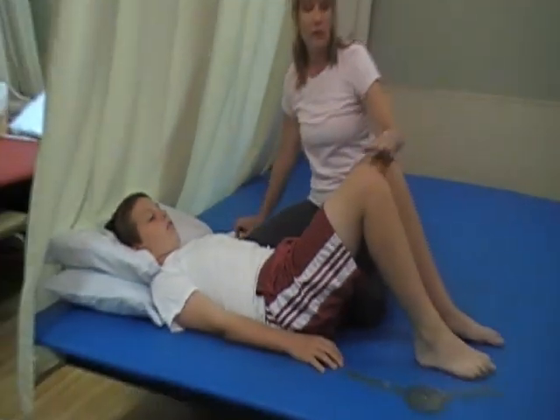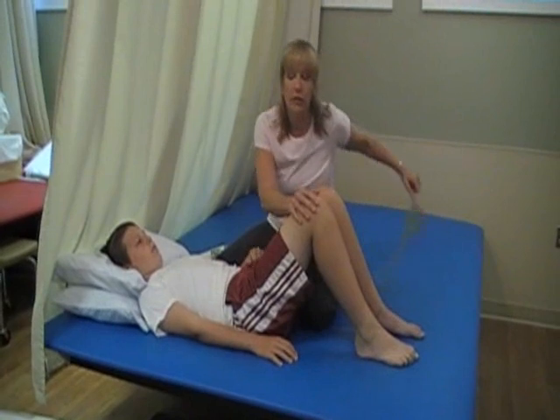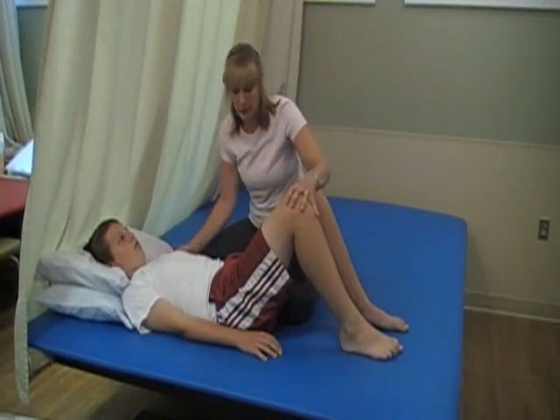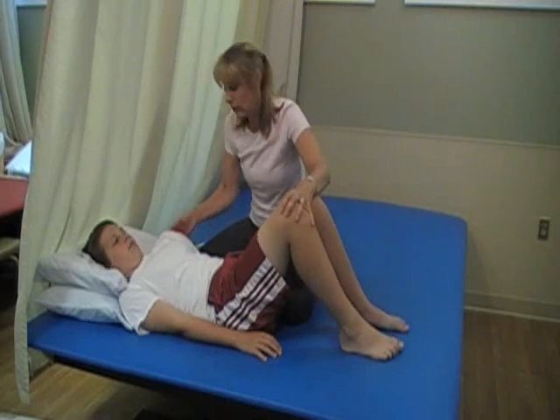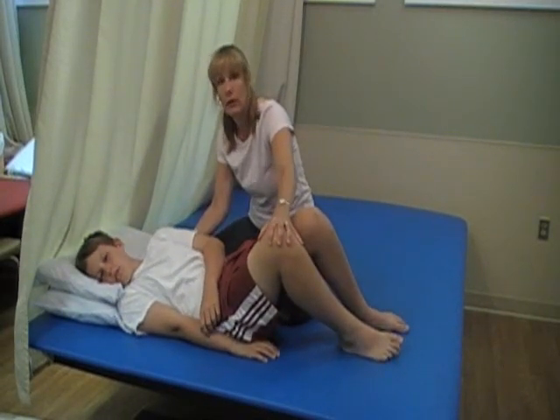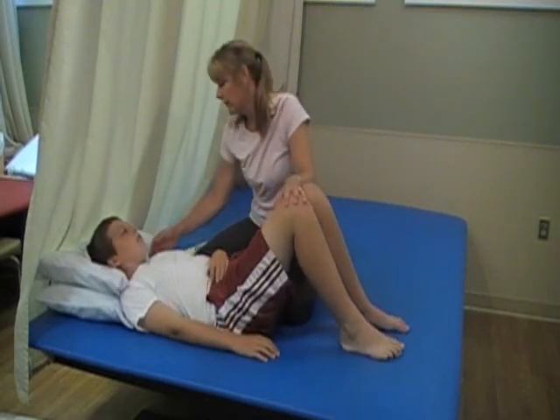Then the last thing you want to make sure that you do before you change positions is looking at their skin. I'm not going to do it here, but you actually would really visually inspect their skin, paying particular attention to the weight-bearing surfaces, their bottom, their back.